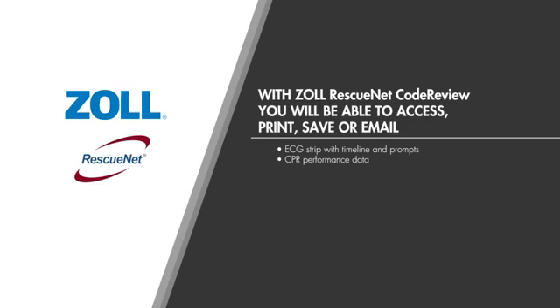Additionally, you have the ability to access CPR performance data on depth, rate, and CPR fraction, which can be useful for training your responders. All data is presented chronologically beginning from the time the AED was turned on to the time it is turned off.